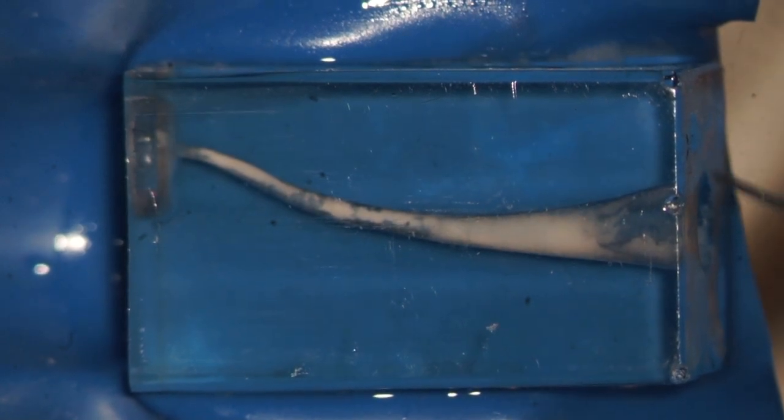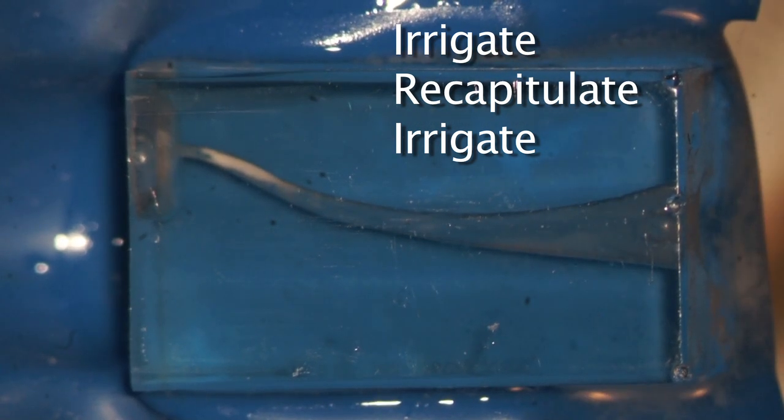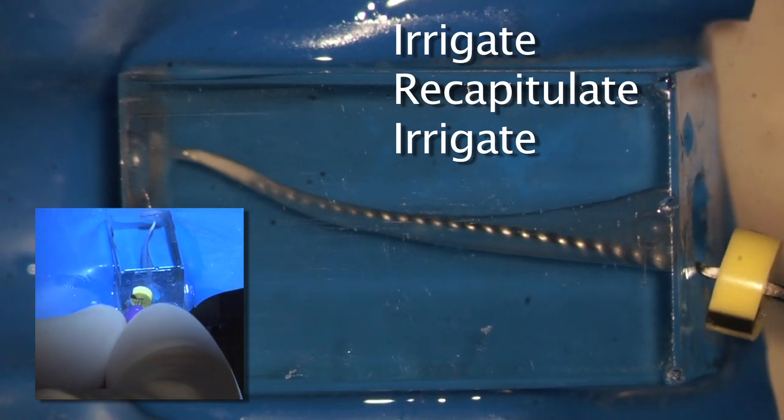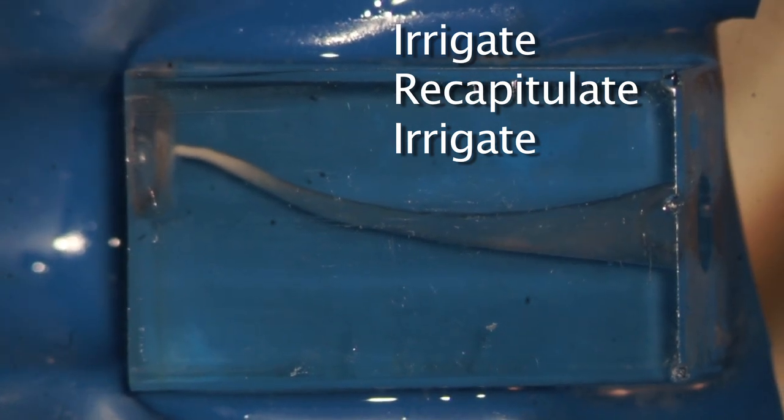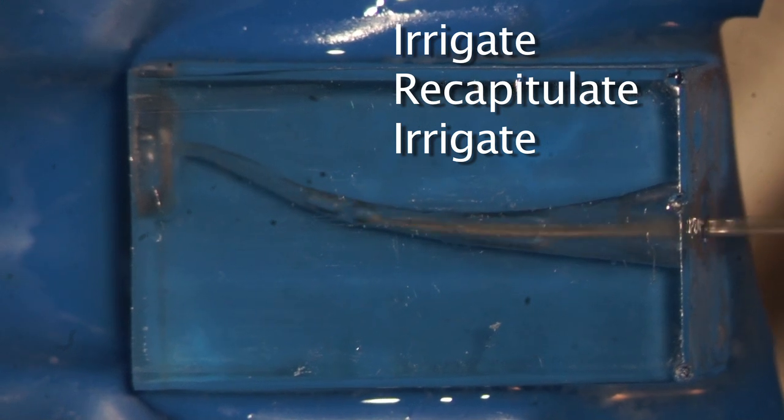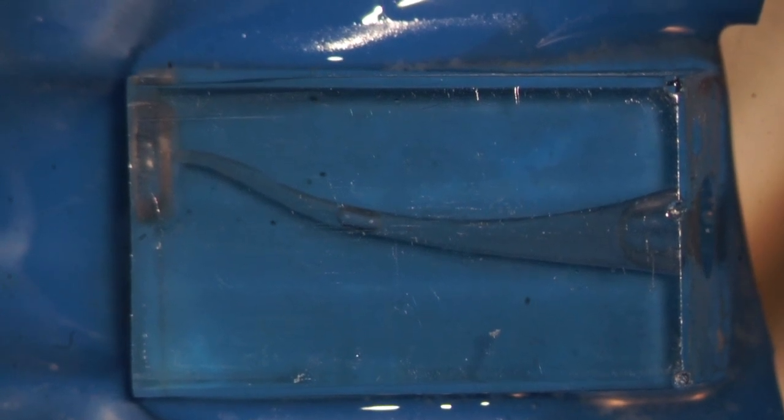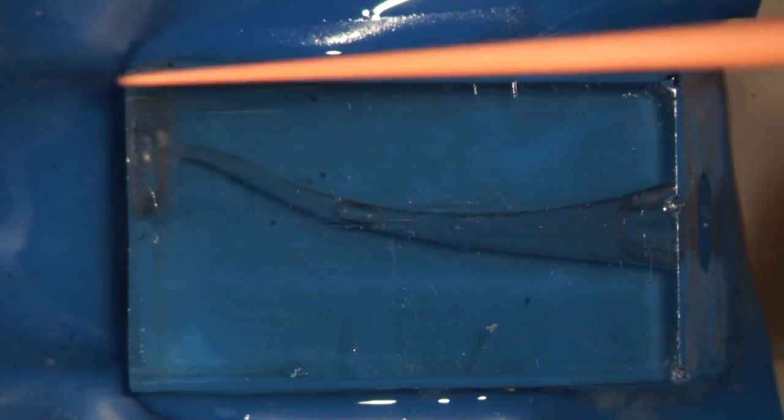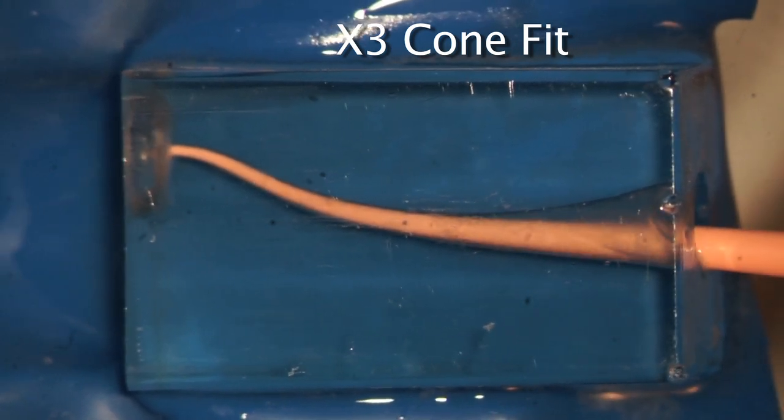Look at the residual debris that's still inside the block. And then we need to always consider the importance of recapitulating. Remember this is stirring the soup. The ten file is like stirring the debris, moving it back into solution, so that when you re-irrigate, you can liberate that debris. And I like to just kind of move the instrument gently but loosely at length. Now that I have loose debris, I can come back in with my irrigating syringe, and I can liberate this debris. So now you have a fully shaped canal. This would be pretty much appropriate for the vast majority of the canals in multi-rooted teeth in the posterior region. Again you could size a carrier if your choice was carrier-based obturation or gutta-core, or in the instance of warm gutta-percha, you could use the matching ProTaper Next cone that's identified with the blue head. And you could just fit that in a wet canal and slide that to length. And there it is.